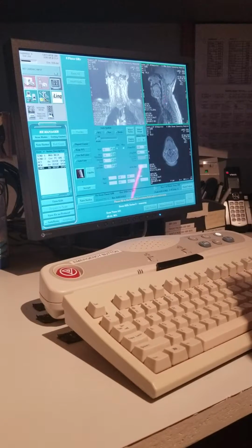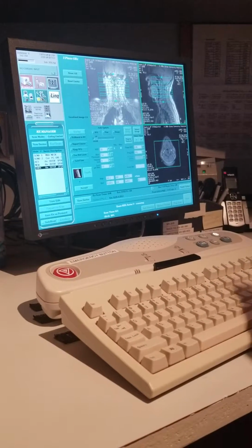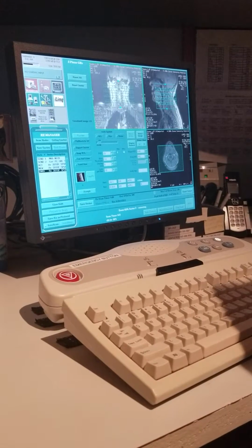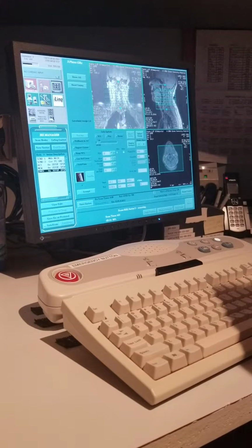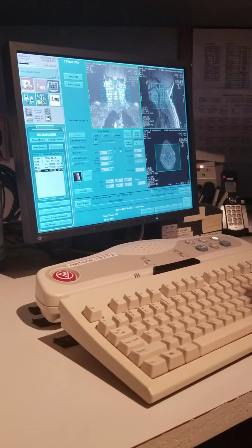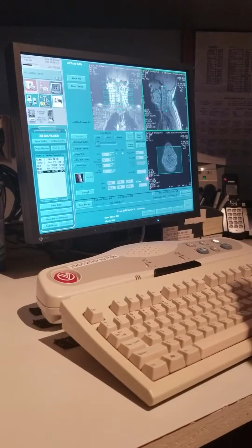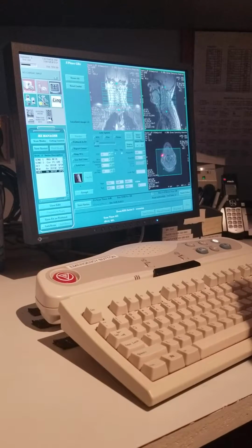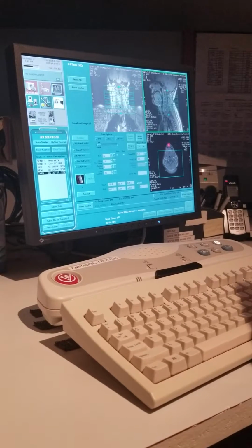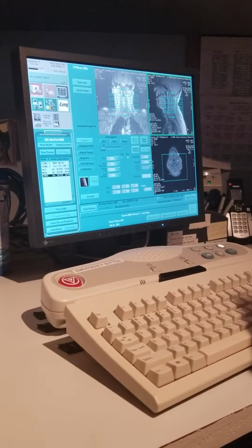And shift it again. Right here. So then bring that down. What we're going to want to do is know exactly where our bifurcation is on the common carotid to center it there. And we'll actually not do as many. We're going to do less, so it won't take as long. Downward? No, that's fine. We're just going to leave it right there for right now.